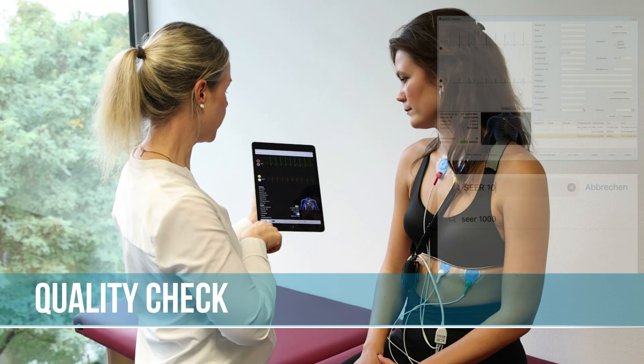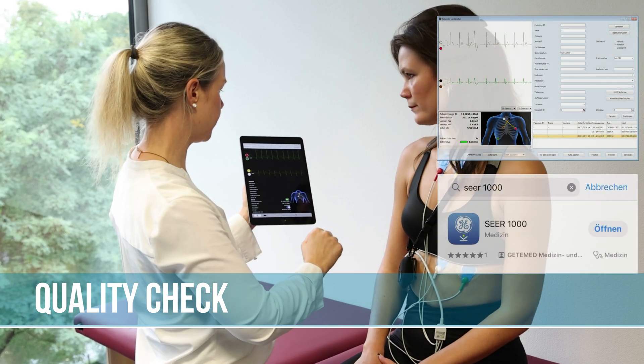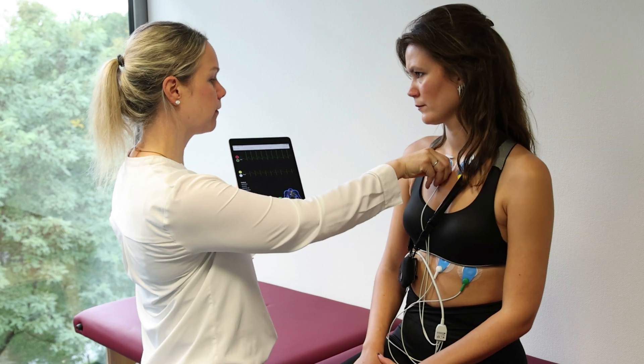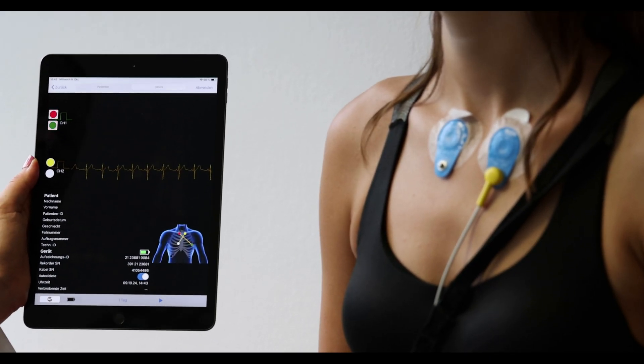Use available software such as CardioDay or the SEER 1000 iOS app in order to connect to the recorder via Bluetooth. You can check the quality of the device setup and identify if a lead is not connected.